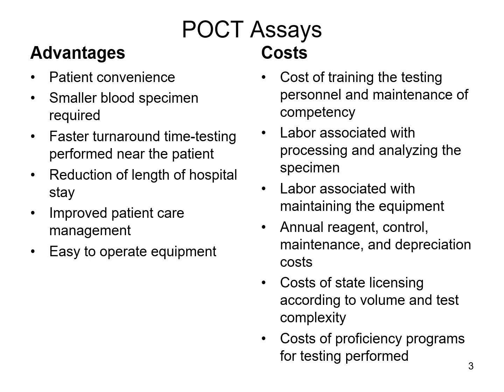So point of care testing does improve patient care management because a lot of times, if the physician can avoid sending the patient to the hospital, it usually is a better outcome for the patient, because a lot of people don't like to go to the hospital and be exposed to additional things or run up bills and things like that. So if they're able to treat without that hospital visit, that's always a good thing. And most of the equipment's fairly easy to operate.